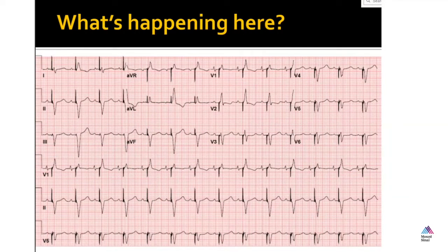So how would you know if it was single or dual chamber based on this tracing? So maybe a variation in the heart rate that could be more of a sign of a dual. Yeah, that's true. But why would there be variability in the heart rate in a dual chamber pacemaker? I agree, you would see more variability. Because of the pacing of the chambers. Well, the sensing. Right, because there would be sensing, right?